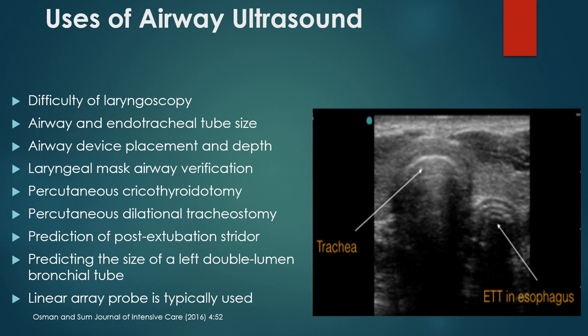And finally, we're going to evaluate the epiglottis as well, and some type of utility, you know, to, again, tool versus toy. I'm not sure of these 8 or 10 bullet points what you would consider to be part of your practice, but you can never tell in 5 years.